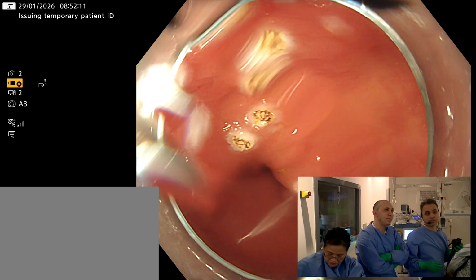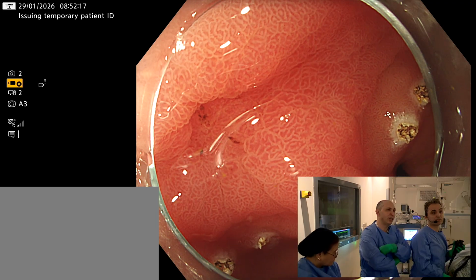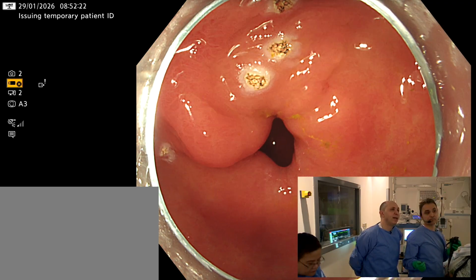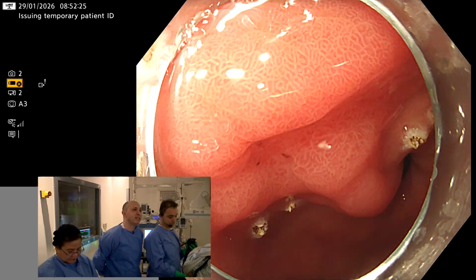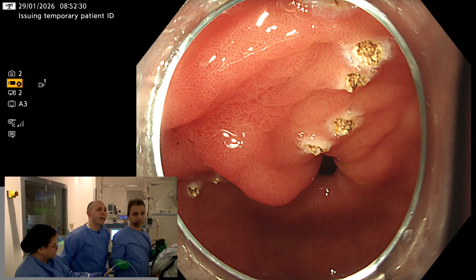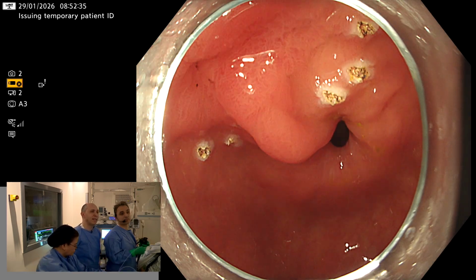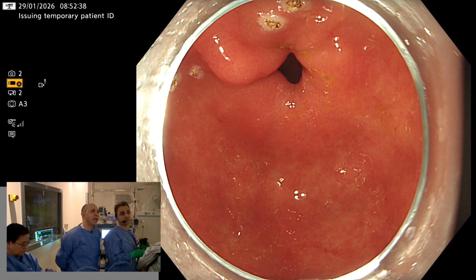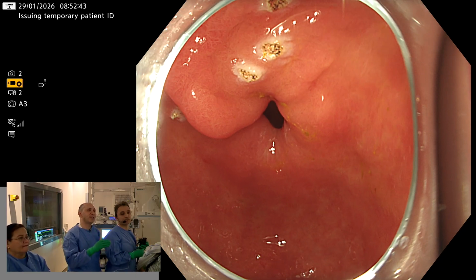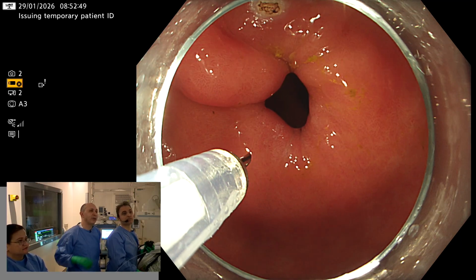Needle injection. First of all, we did the characterization and examination of the mucosa of the lesion, and it seems there is no highly suspicious area, but the patient had an anxious feeling that this could be a tumor, especially as she had before an EUS examination to assess this lesion. So the point is we are trying to illustrate the strategy of doing ESD and superficial resection for this lesion in the antrum, especially as it's lying close to the prepyloric region.